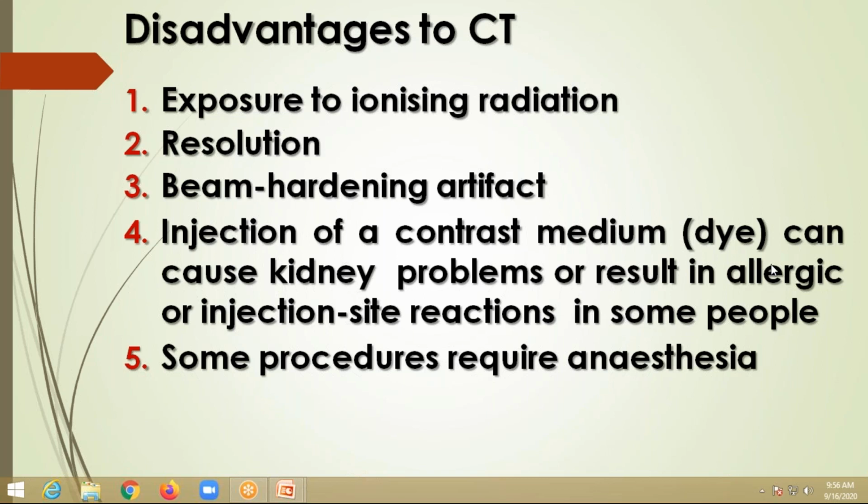These are all disadvantages in CT. Contrast enhanced CT, and some procedures require anesthesia.